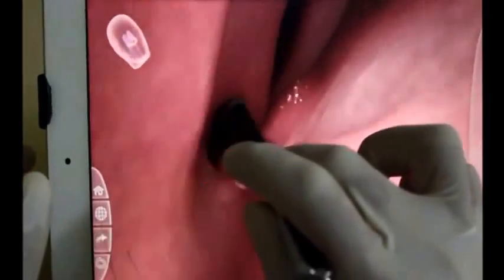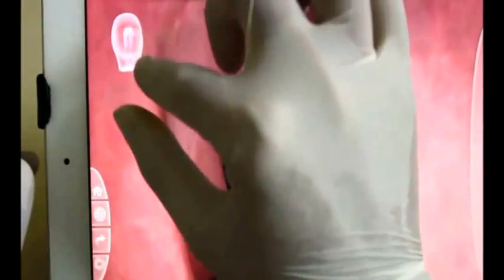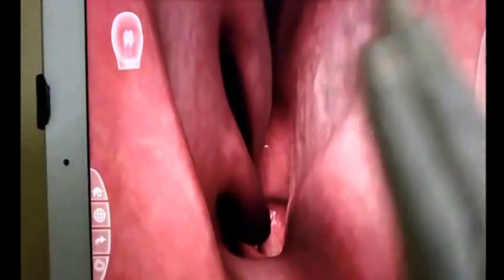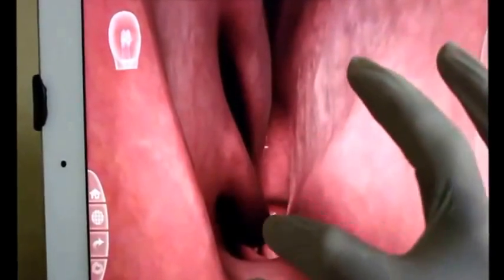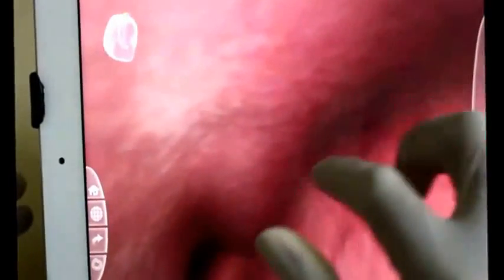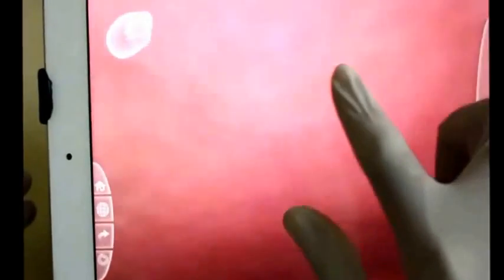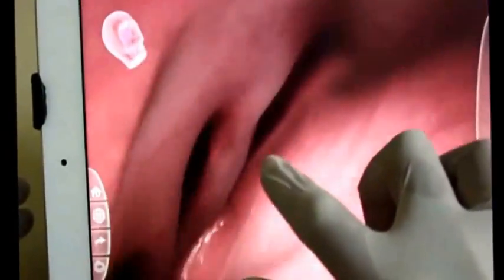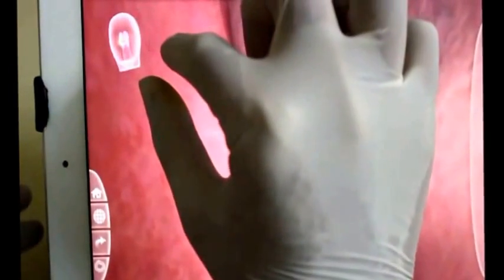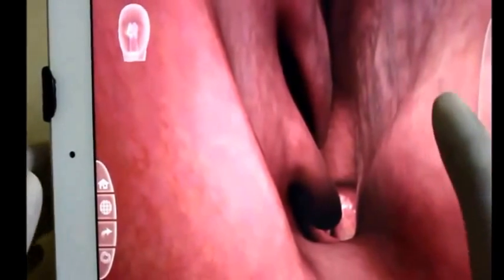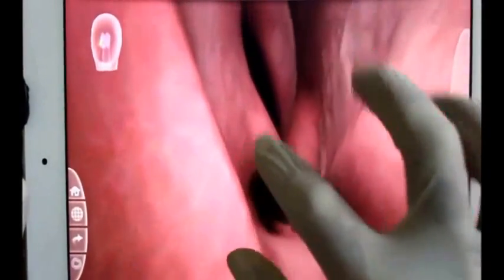Coming up, we can see the conchae — that is the turbinates. Going straight, up we go, right we go, left we go — I will tell you where we go. We can see the upper wall of the nasal vestibule. We can see the mucous covering well. The patient is doing good, no signs of inflammation. We are doing rhinoscopy on a normal patient just to understand the anatomy clearly.